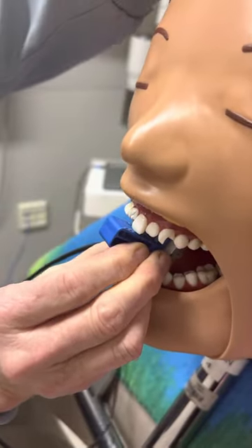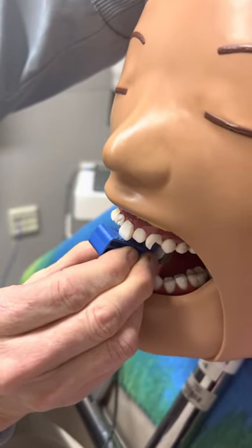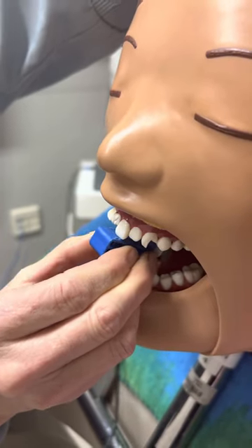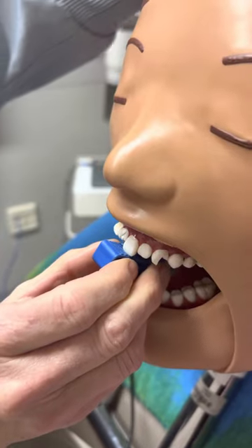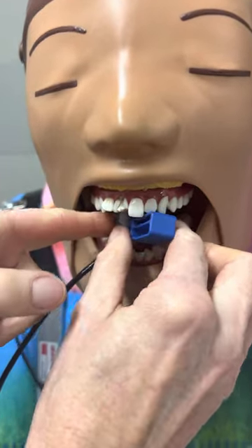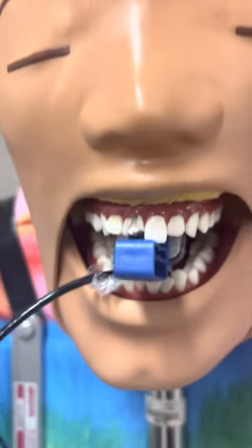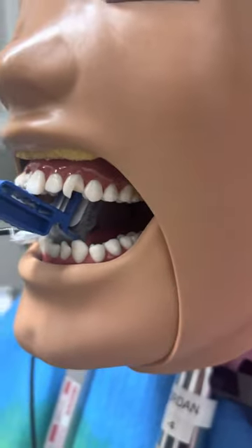The placement is exactly the same. Don't have your patient bite down very hard, just until they hold it. For bisecting, your sensor is going to be close to the teeth — not necessarily in the center of the mouth, but close to the teeth. Here's a patient with a broken tooth, and you can see how the sensor is placed in the mouth.